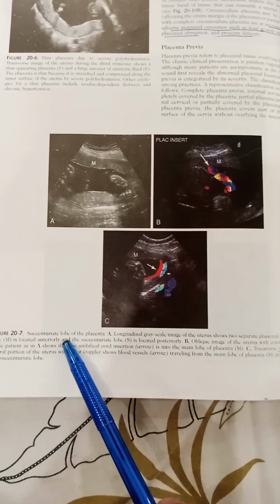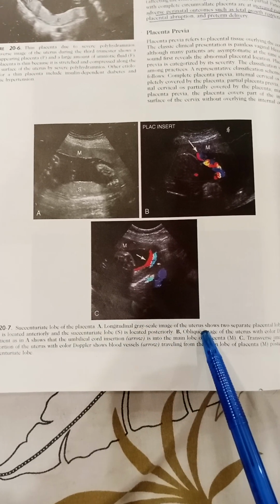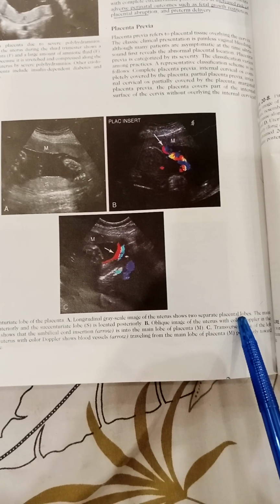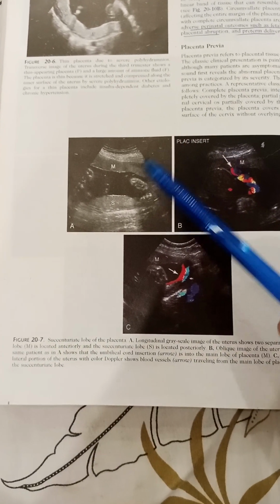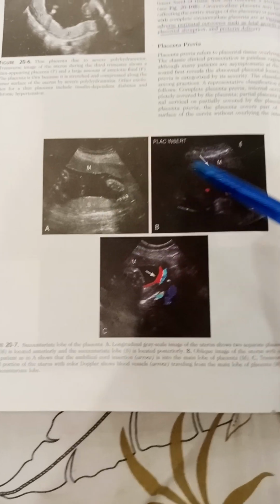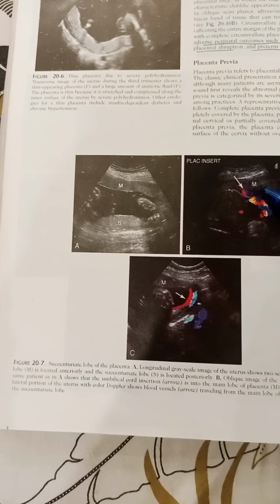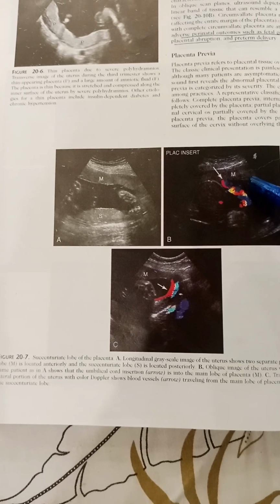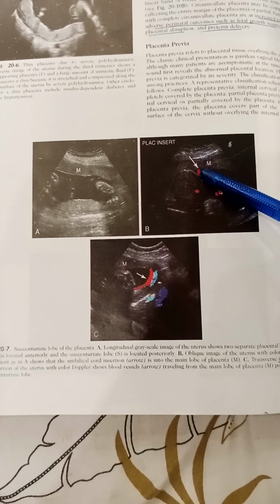So I will read the description over here. Succenturiate lobe of the placenta. A longitudinal grayscale image of the uterus shows two separate placental lobes. The main lobe, M, is located anteriorly and the succenturiate lobe is located posteriorly. Over here, the oblique image of the uterus with color Doppler in the same patient as in A shows the umbilical cord insertion towards the main lobe. It is inserting into the main lobe.